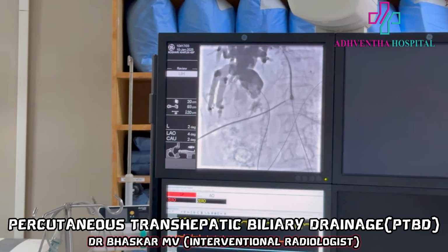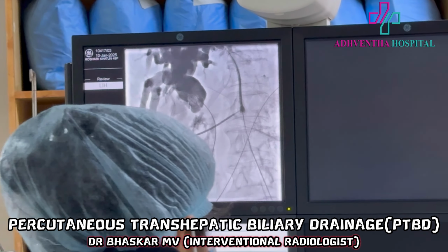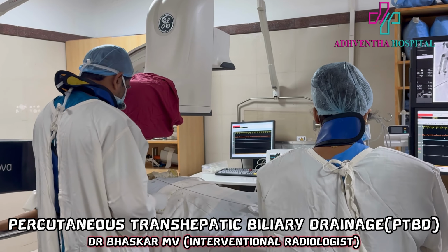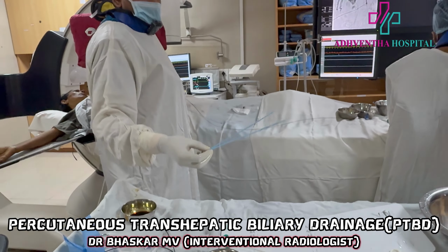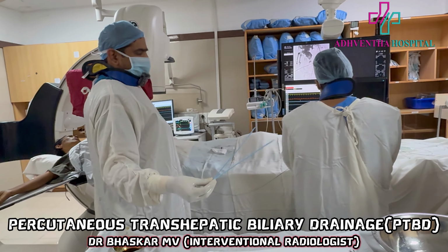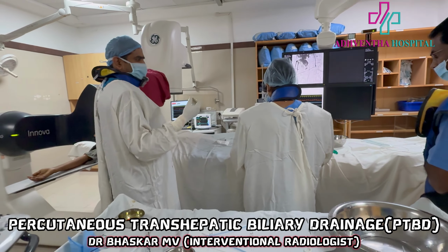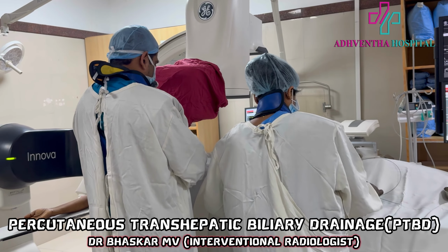So now I am going to remove the sheath and do the serial dilatation of the tract. Ideally, this is used to dilate the skin. Skin is the most resistant part of the tissue. First we can give a small nick so that the opening will be easy.